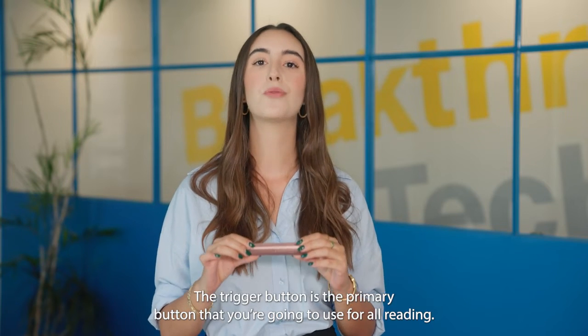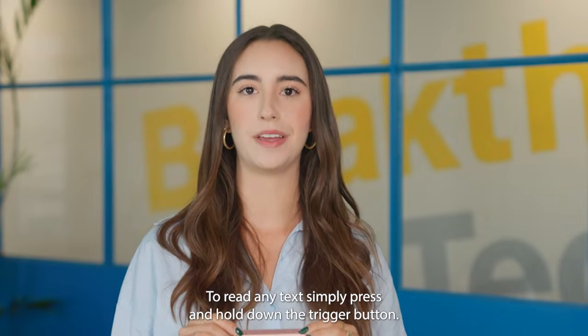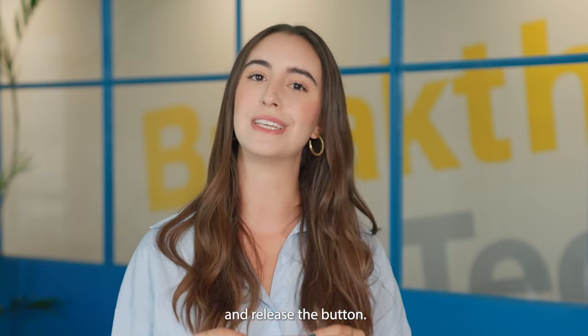The trigger button is the primary button that you are going to use for all reading. To read any text, simply press and pull the trigger button, then position the rectangular laser frame so the desired reading area is within the laser frame box and release the button.